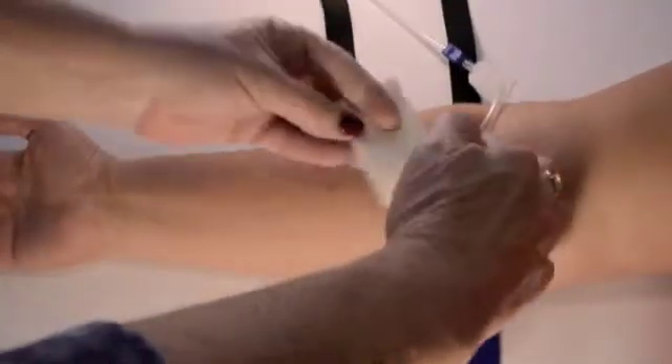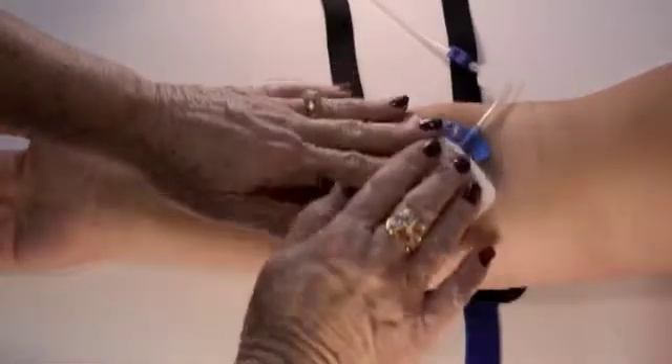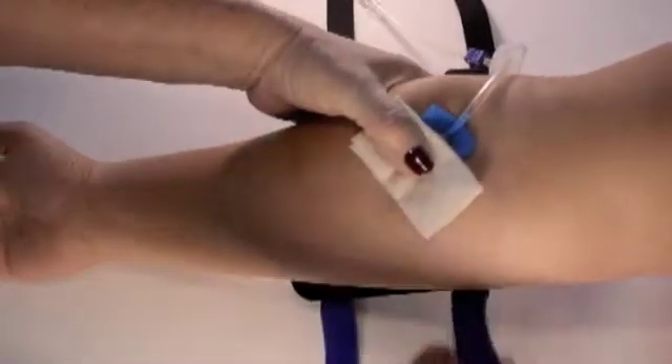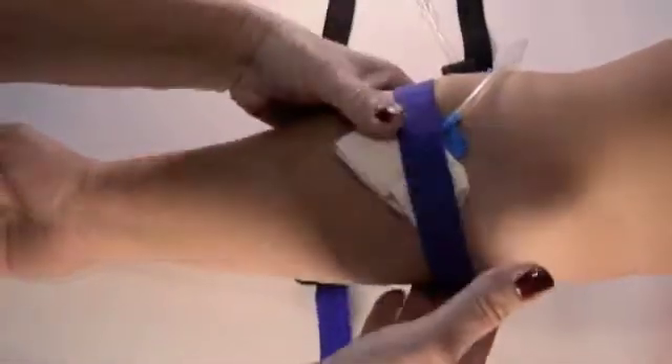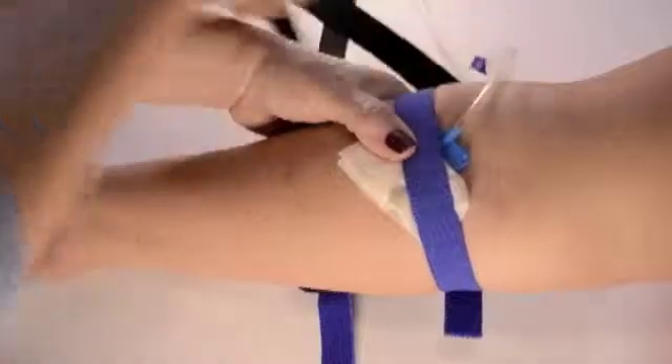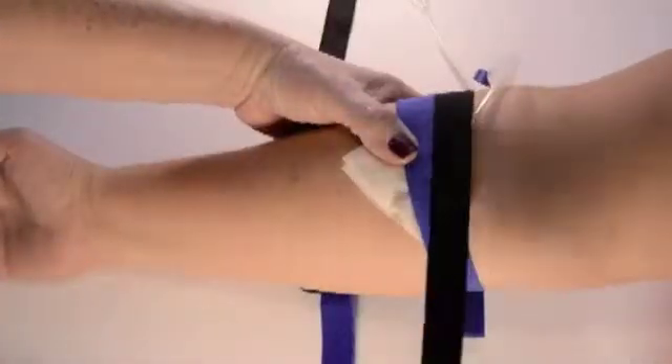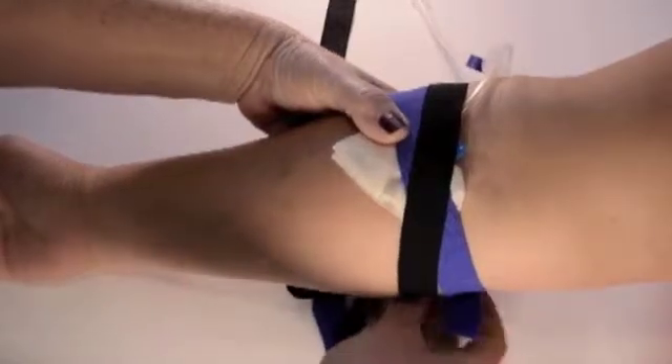With the first needle, use a piece of gauze over the site and cover the needle at the skin penetration point. Use one hand to hold the unit in place while using the other hand to guide the straps to cross over the needle butterfly. Take the blue strap and place it gently over the butterfly, continuing around the arm and attaching it to the saddle. Next, take the black strap over the butterfly from the opposite direction, around the arm, attaching it to the saddle.